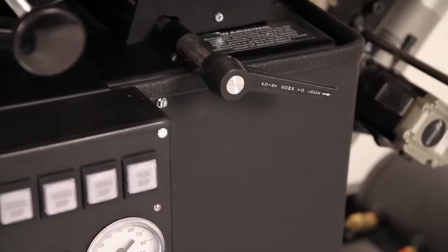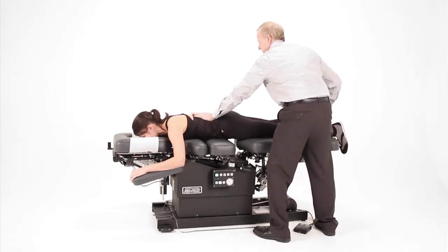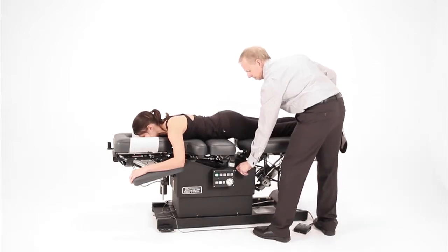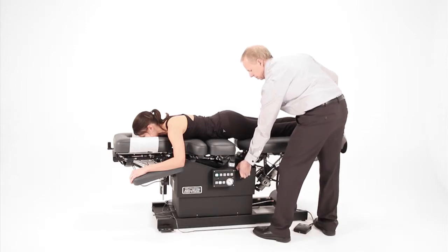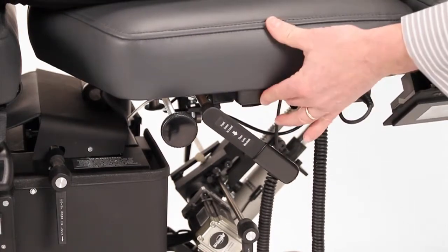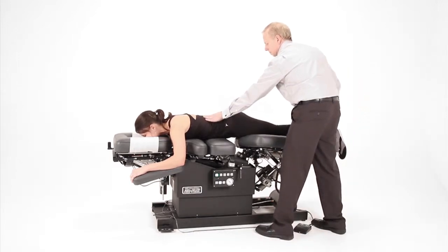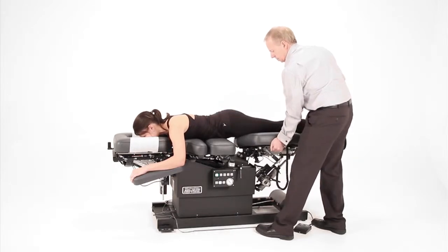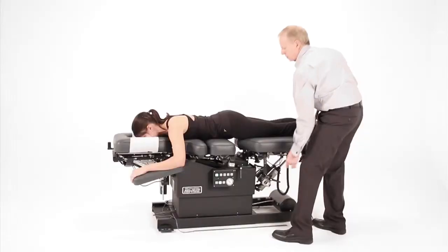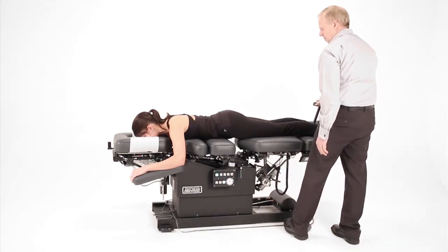To use lateral movement with flexion, disengage the lateral handle counterclockwise. This combination will allow you to perform smooth and effortless circumduction. The table also comes with rotation, which uses a double locking system. Disengage the large centering handle, then unlock the switch to rotate the pelvic section freely. From there, you can treat at a specific rotation angle by locking the switch. When the treatment is finished, select distraction and use the pressure pedal to retract the table and your patient inwards.